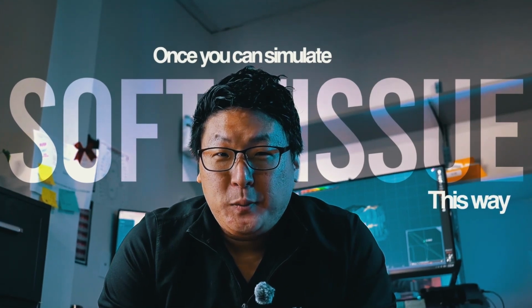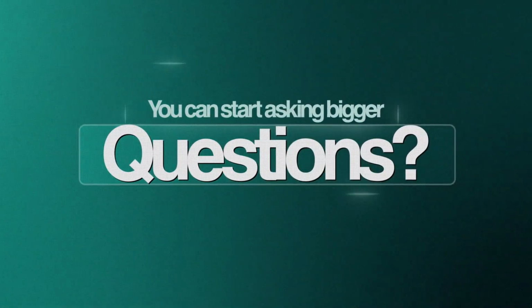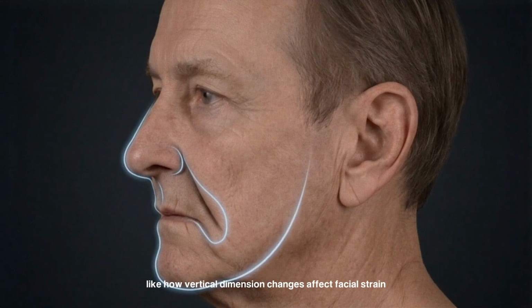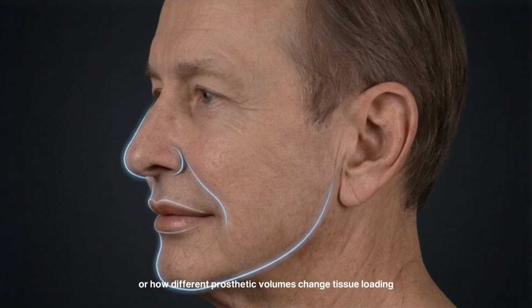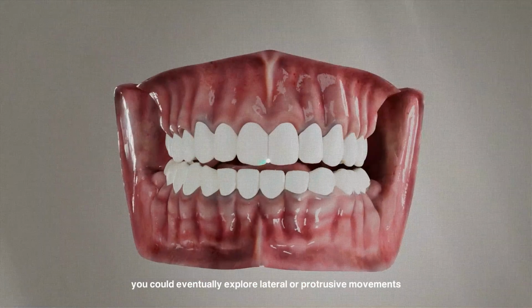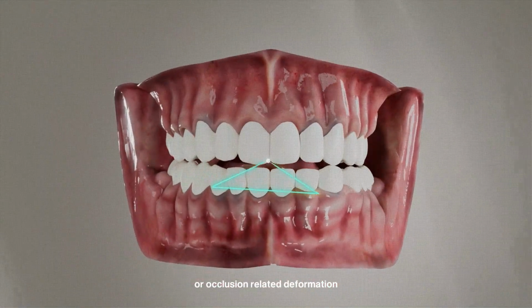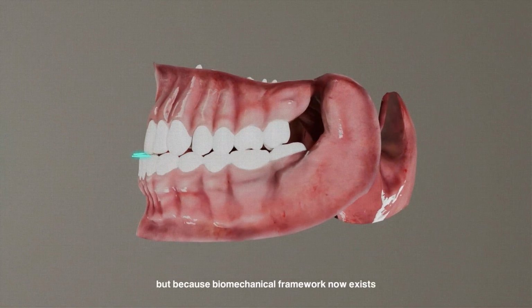Now here's where my thinking expands beyond the paper. Once you can simulate soft tissue this way, you're not limited to just lip support. You can start asking bigger questions, like how vertical dimension changes affect facial strain, or how different prosthetic volumes change tissue loading. You could eventually explore lateral or protrusive movements or occlusion-related deformation, not because this paper proves it, but because a biomechanical framework now exists.